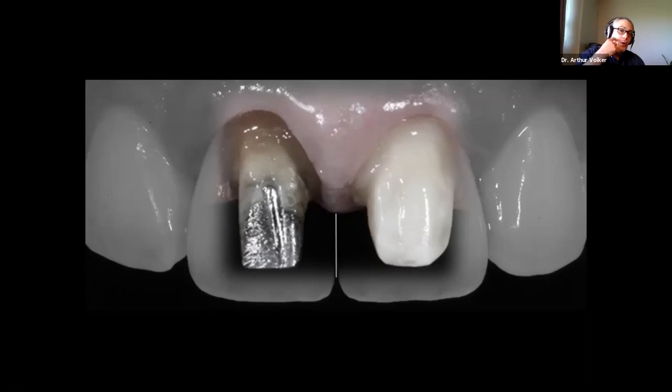Now, there are other ways to opaque. I know Dr. Lane Ochi, who many of you know, in Beverly Hills, he advocates the use of basically a taco shell to cover the, almost as a coping over the discolored area and then the crown. And that absolutely can work. And he's a master of his craft, and that works. I have found that this works equally well without the extra step for myself.